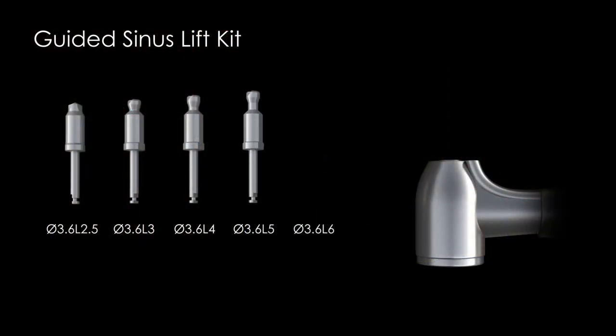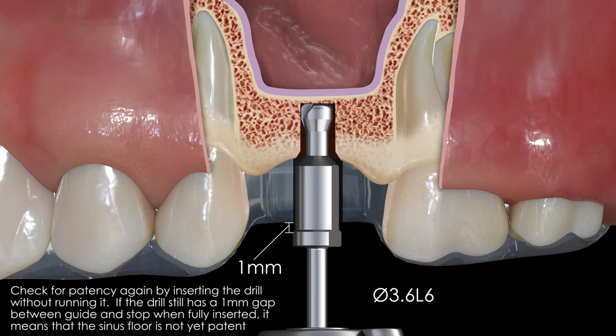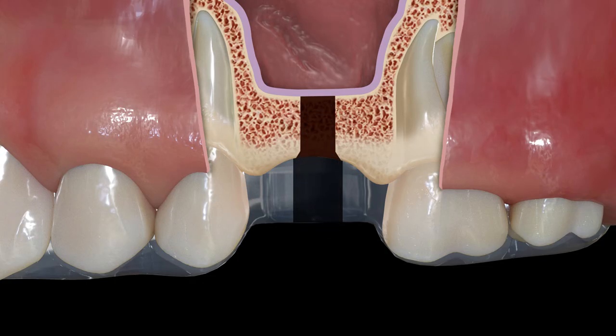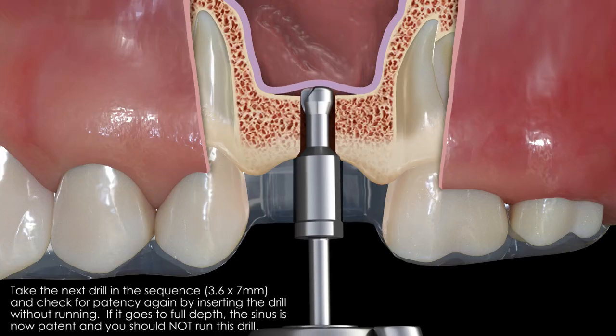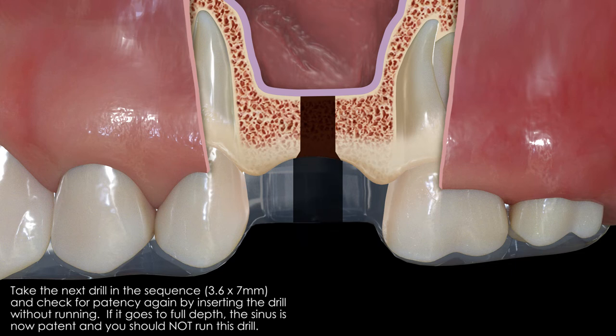Repeat the process by inserting the 6 millimeter drill to depth without running it. If there is still a gap between the drill stop and the guide, then drilling should proceed since the sinus floor is not yet patent. Now take the 7 millimeter long drill to full depth without running it. Note that this time the drill stop seats completely. This confirms that the sinus floor is now patent without having to rely on tactile sensation alone. This method should greatly reduce the risk of a sinus membrane perforation since the depth control prevents any excessive pressure on the membrane.